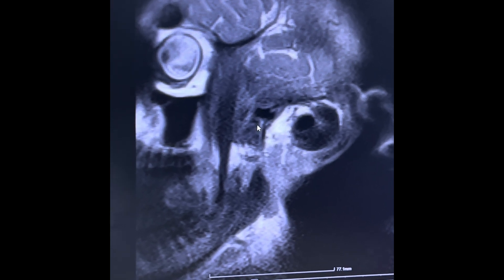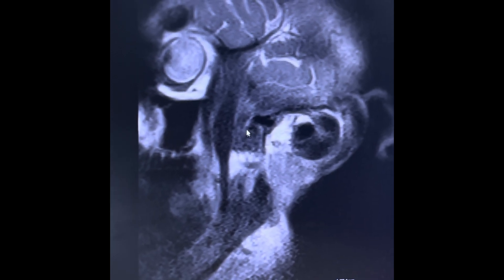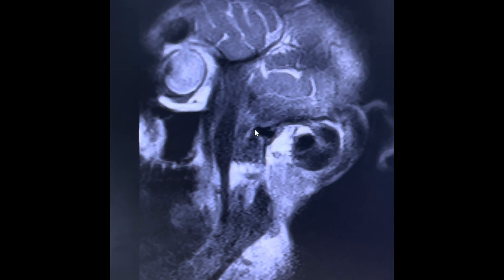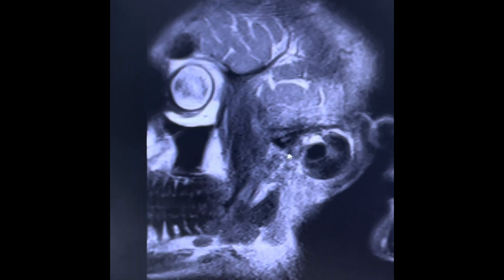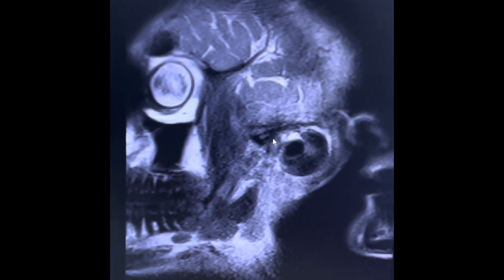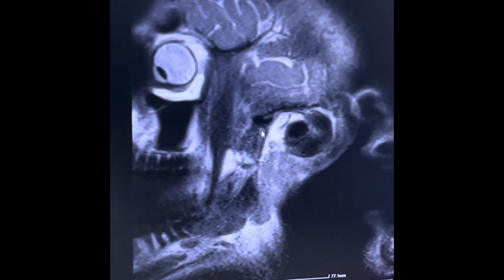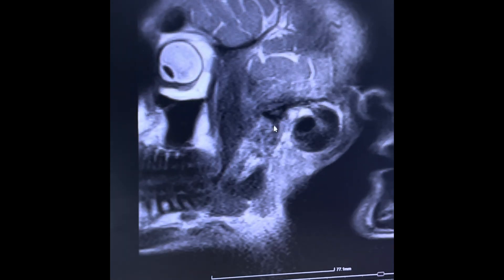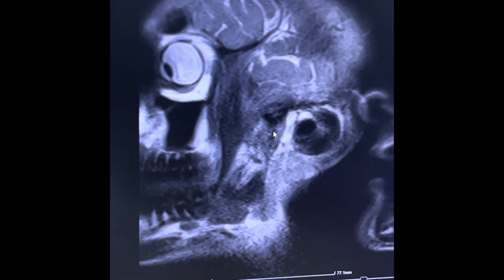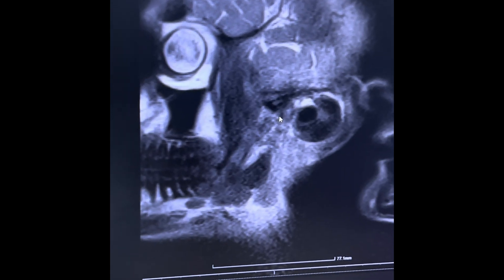In this case the patient is slightly hypermobile and the condyle can actually move very far through the joint to a condition called subluxation, but the disc here you can see has reduced and gone back to its correct position. So this is internal derangement with reduction — the disc is not where it should be, but it reduces back to the normal position, and this creates a clicking noise. In this patient's situation it's a painful annoying click and they wanted to have it treated.